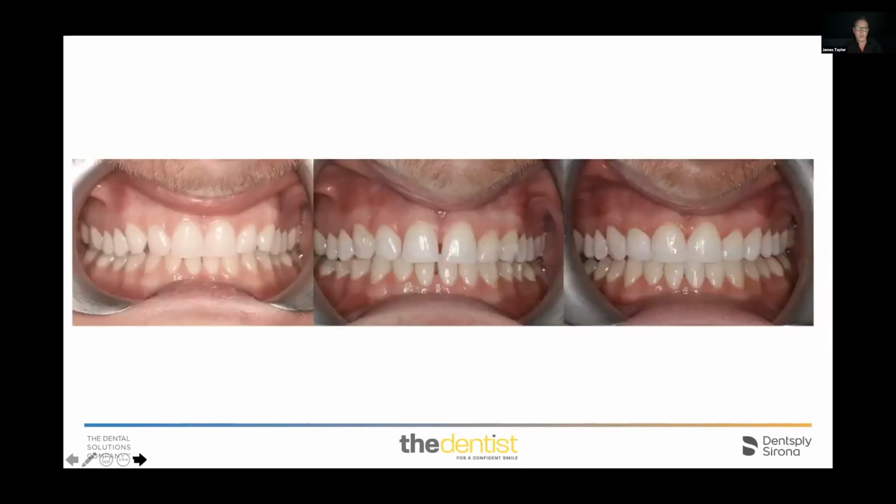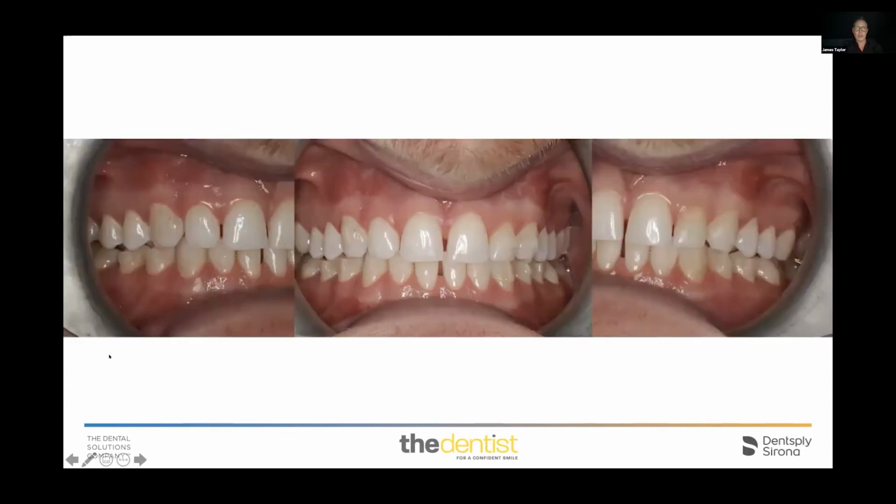And so we looked at all aspects, and what we essentially did, using SureSmile, is we opened up space, so we expanded his arch but actively increased the size of his teeth using composite bonding, and planned that as part of the case. You can see that after we'd done the aligner treatment, he was left with spacing. So we actively encouraged space creation to give him increased width.